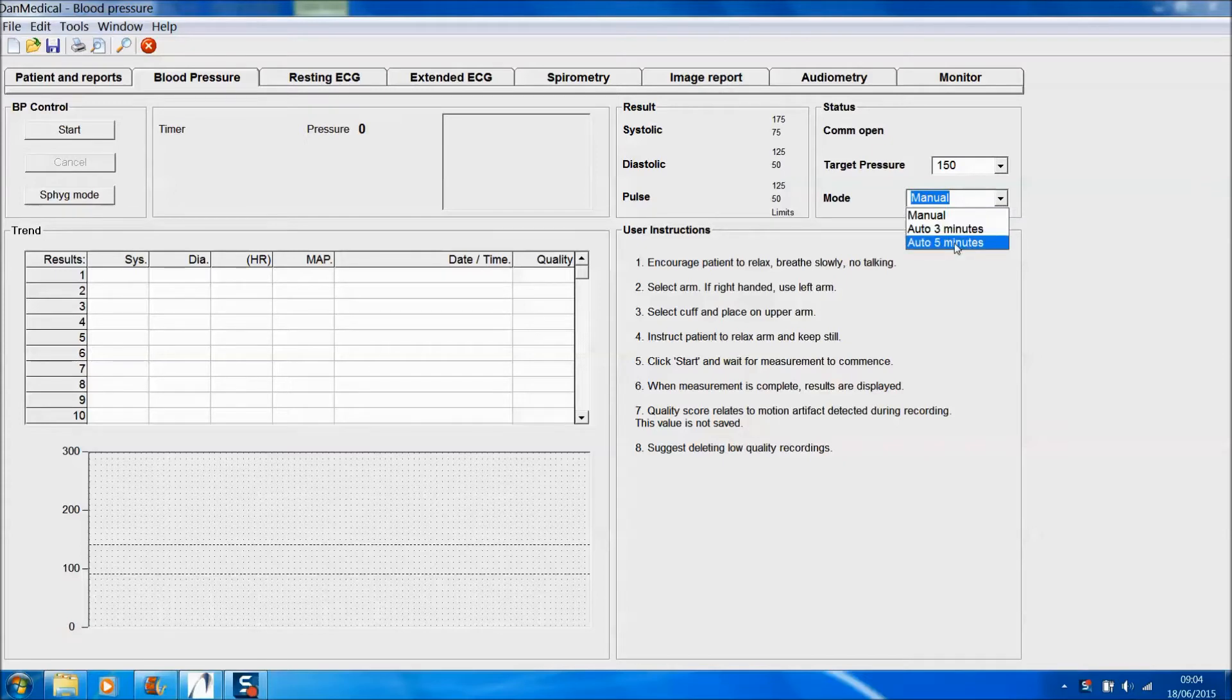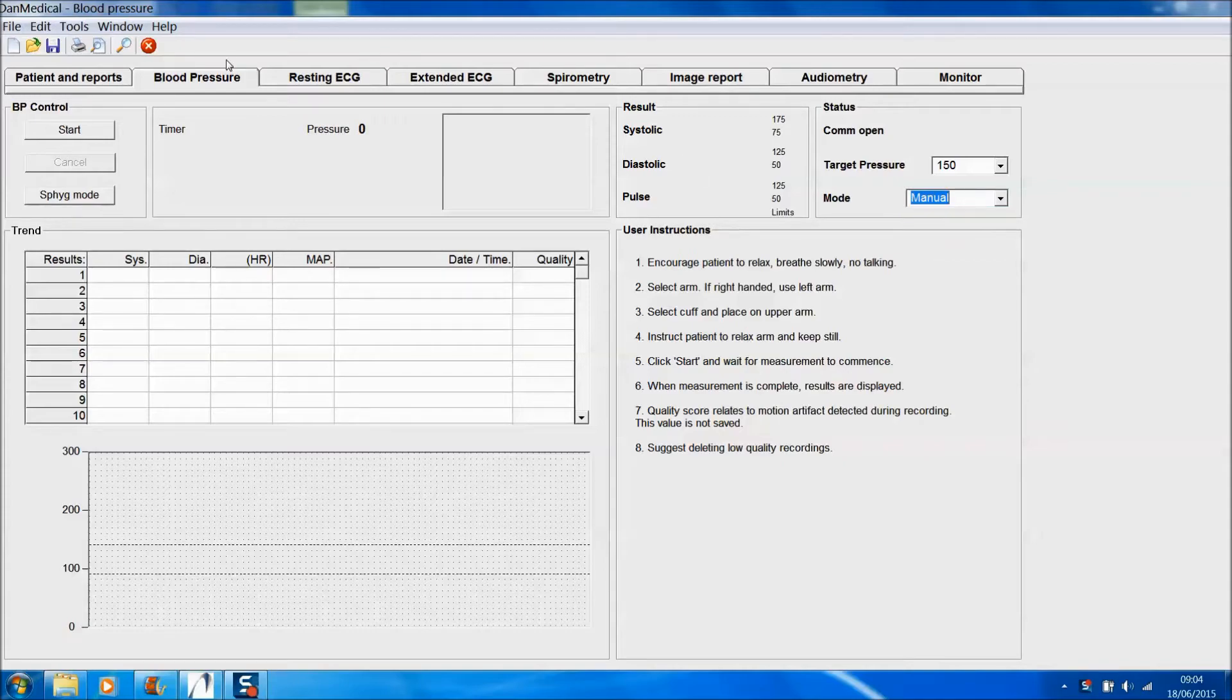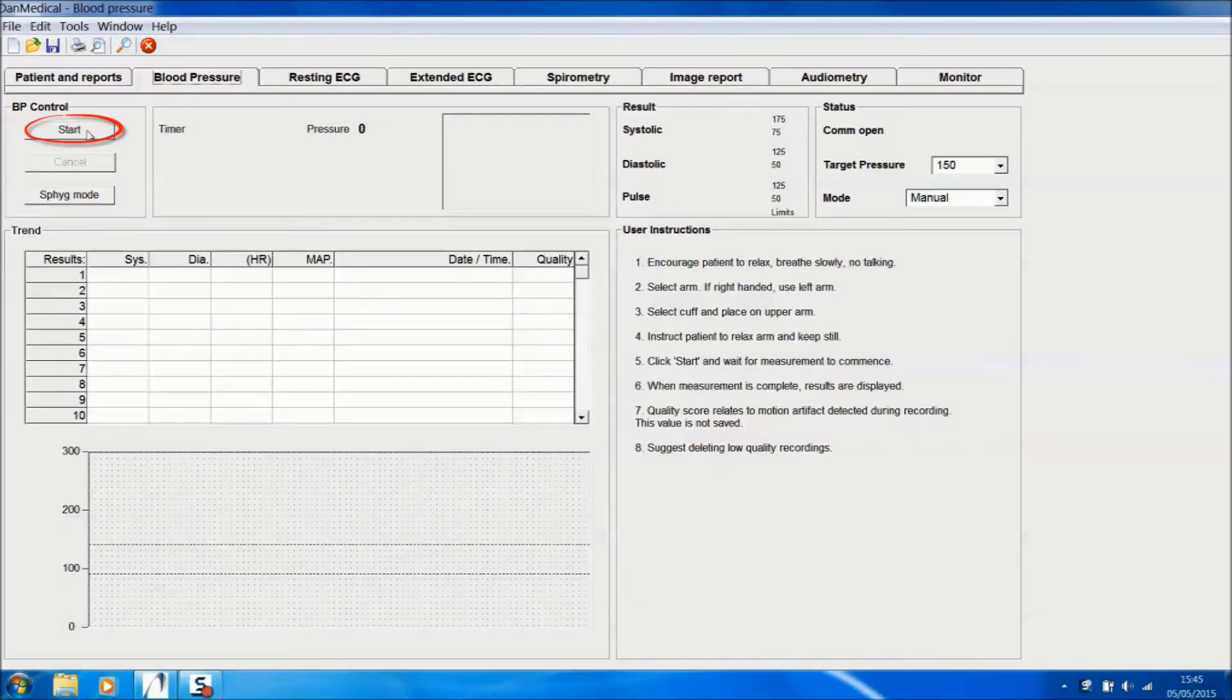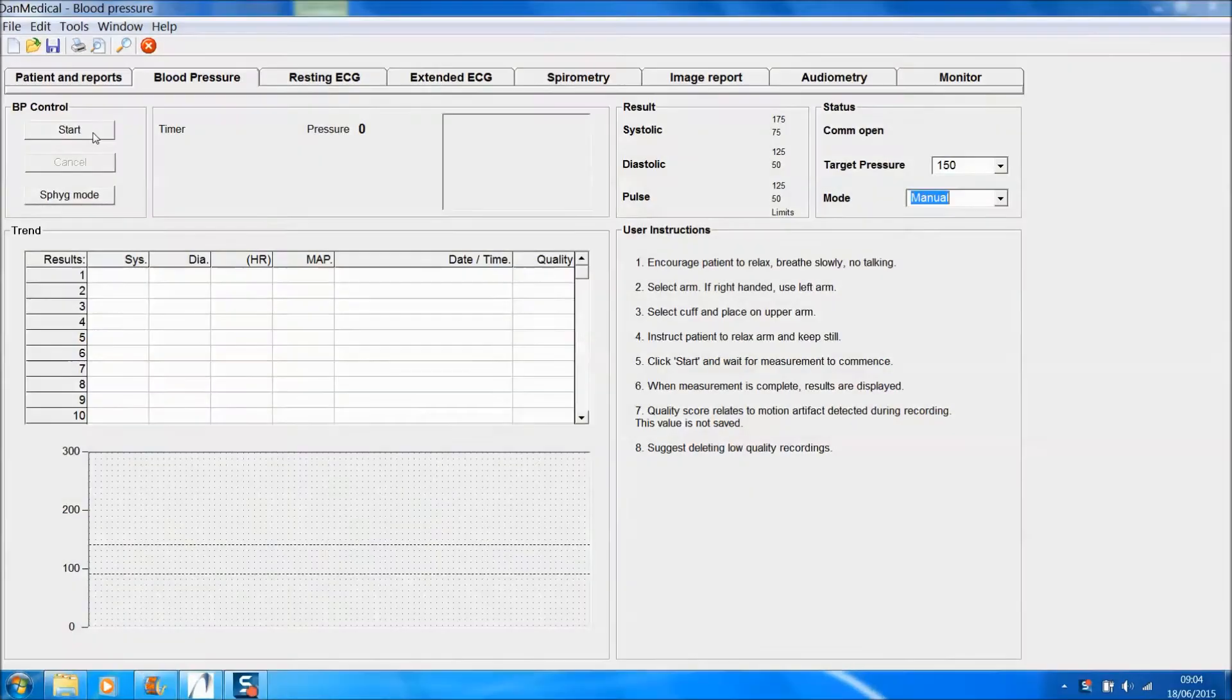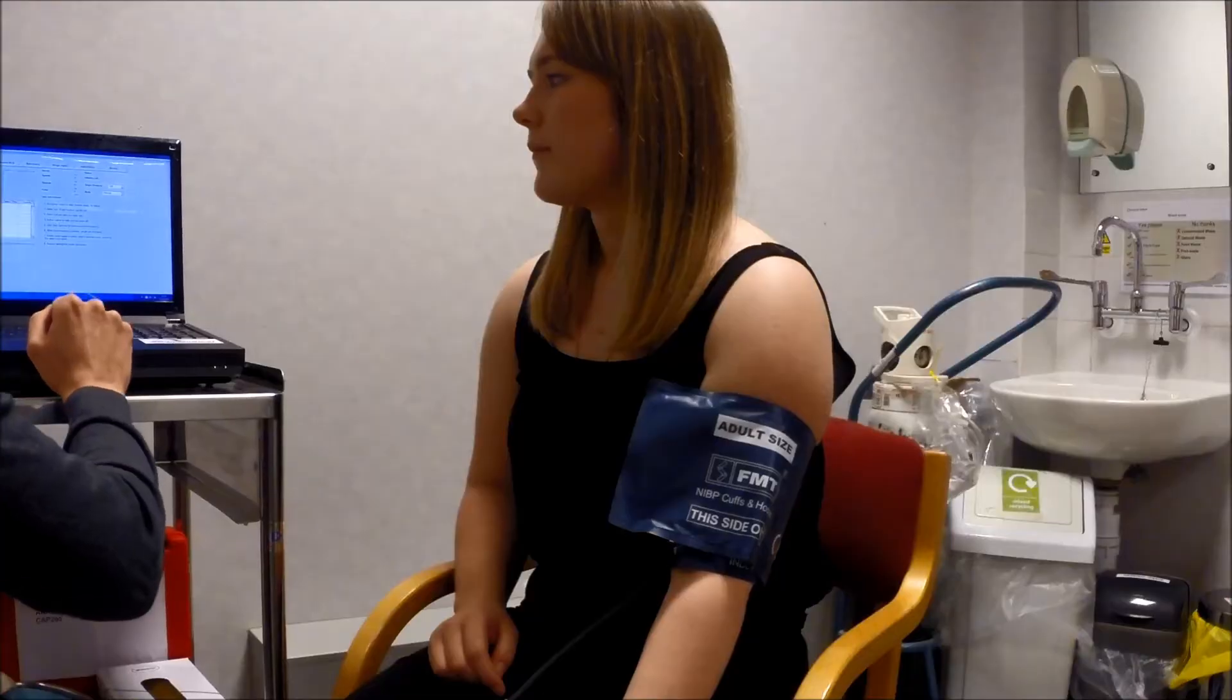Normally the software will take one blood pressure, but if you wish you can use the drop-down menu to take a series of blood pressures automatically for three or five minutes. When the patient's ready, click Start.